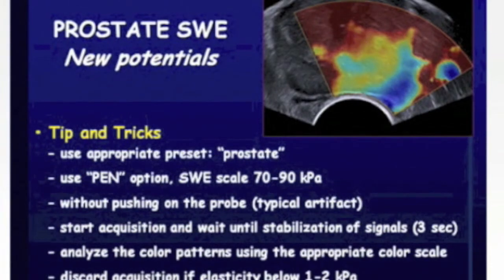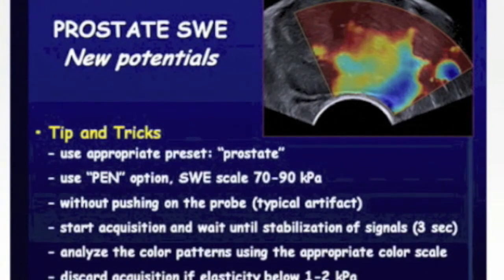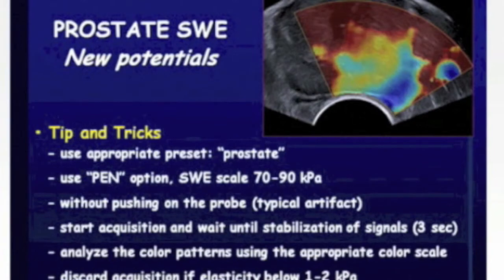As a new imaging technique, there is a lot to learn about the scanning approach. You should use a prostate preset and the penetration option. The shear wave scale should be adapted to the organ and situation — we maintain the maximum shear wave elastography value between 70 and 90 kilopascals. The critical point is not to push on the prostate with the transrectal transducer, because as you can see in this loop, when pressure is applied, the entire prostate becomes extremely stiff and red — red indicating stiff areas. Then we start the acquisition, wait to stabilize, and analyze the color pattern using the appropriate scale.